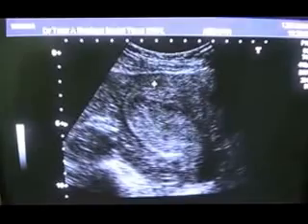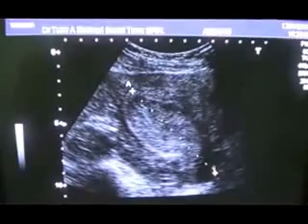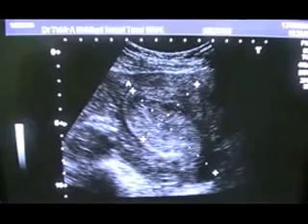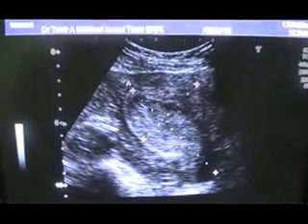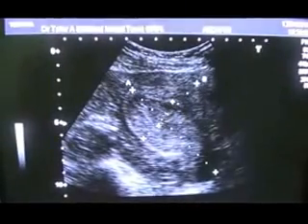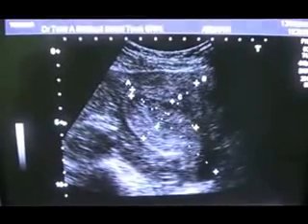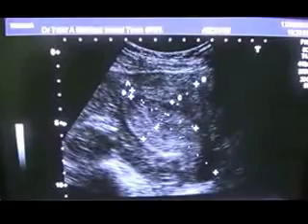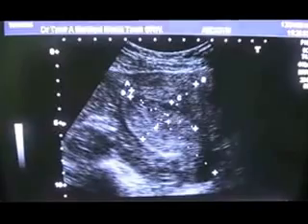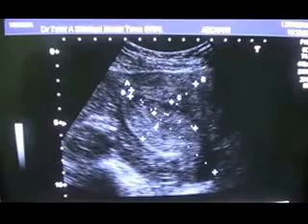All of this is the uterus. This is the outer boundary of the uterus, and the uterus measures 9.0 into 5.5 centimeters, and this is the endometrial canal. This area, from here to here, and from here to here, that is visualized, measures 21.7 millimeter in anterior-posterior diameter, and 5.2 centimeter in length.